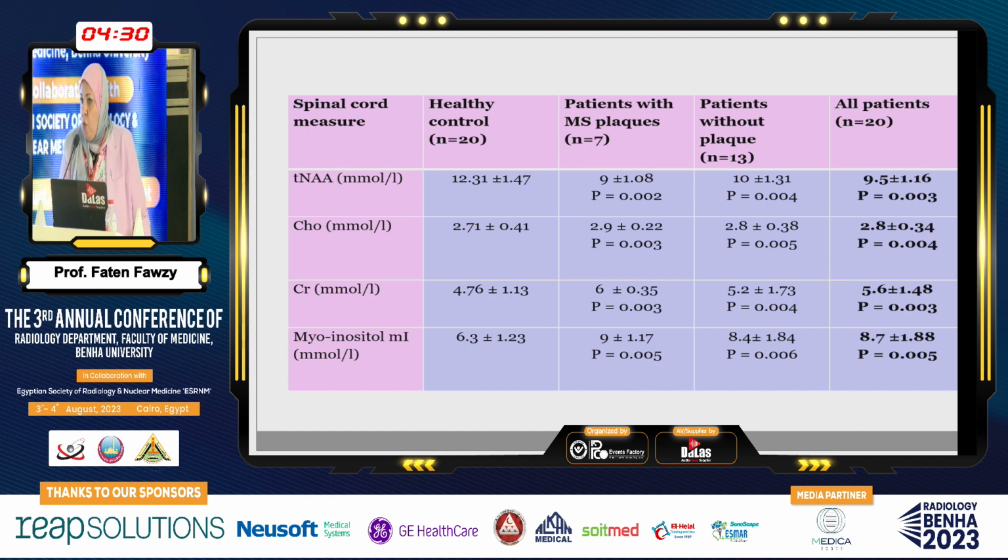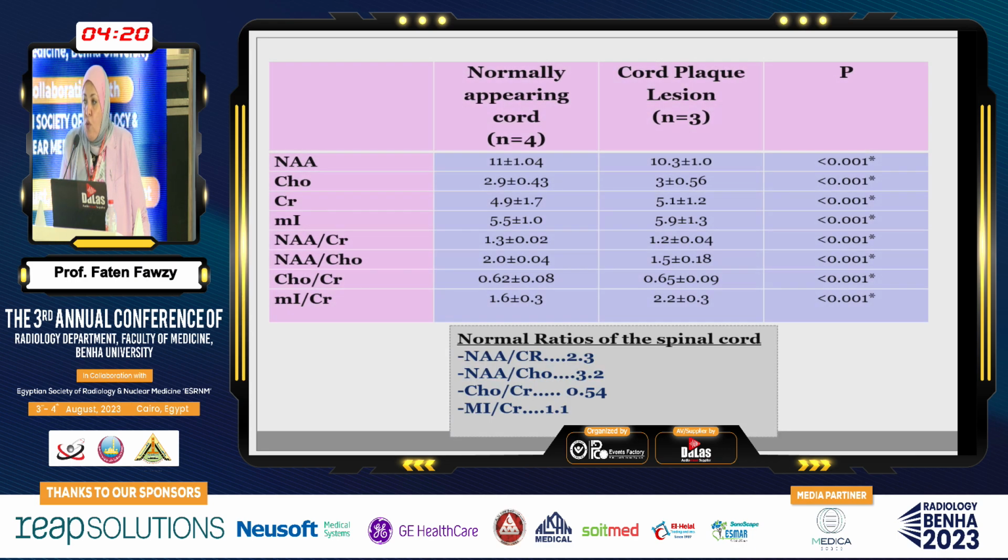This table shows the metabolite alteration as regards their concentration and the peak height in a study done in the Faculty of Medicine, Zagreb University, and also the alterations of the ratios relative to the normal ratios.